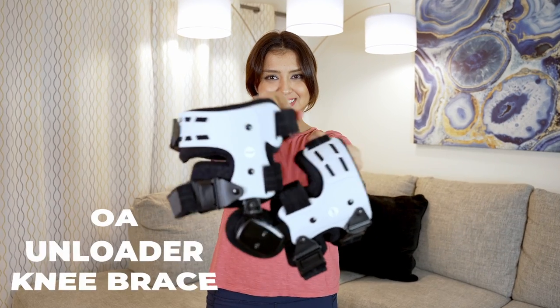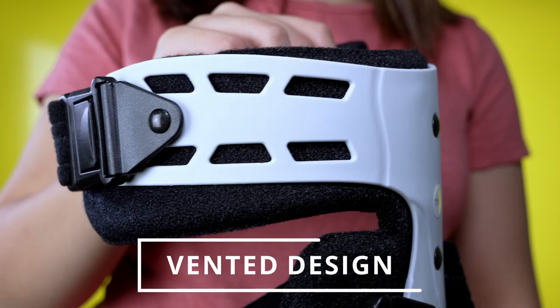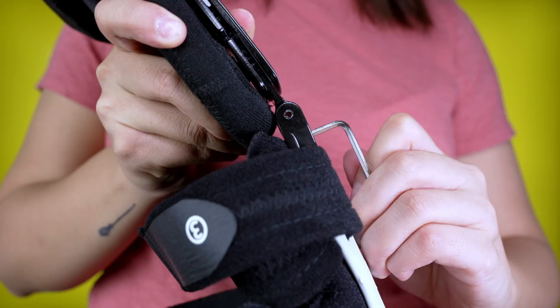I want to show you this adjustable knee brace and how to use it. It has four quick release buckles and is vented for breathability. You can easily adjust the varus and valgus angle for more comfort on your knee, and also add flexion or extension stops to control your knee.